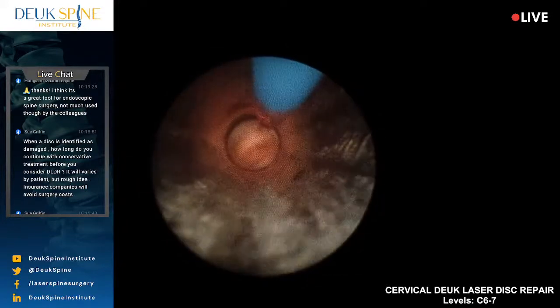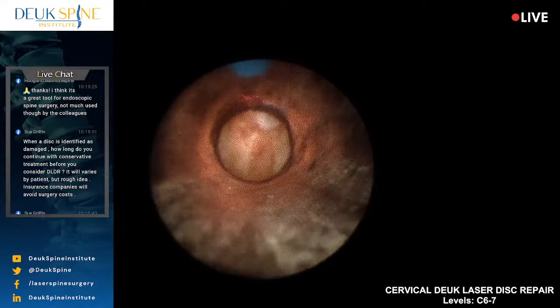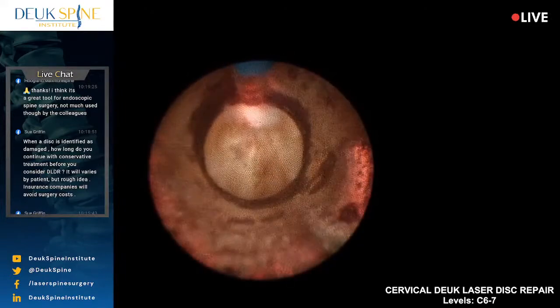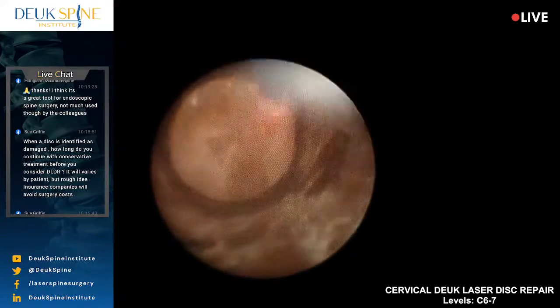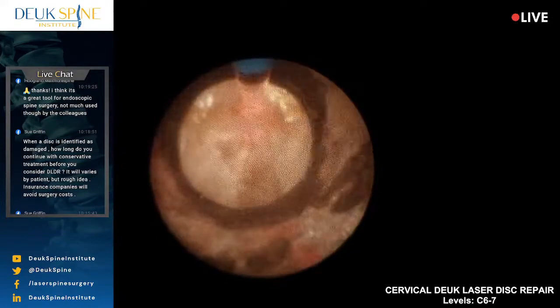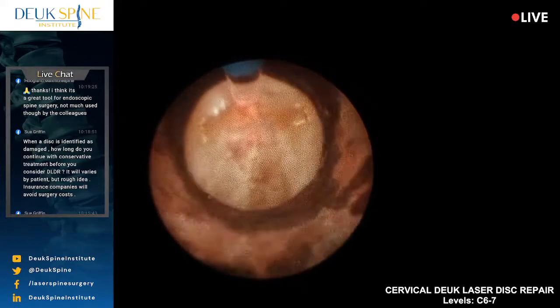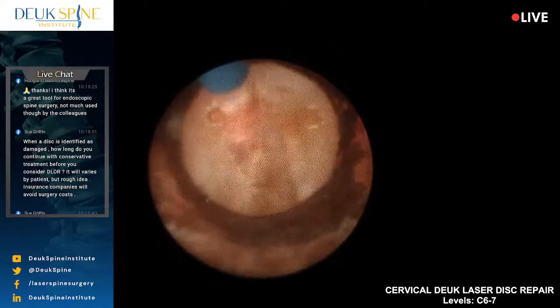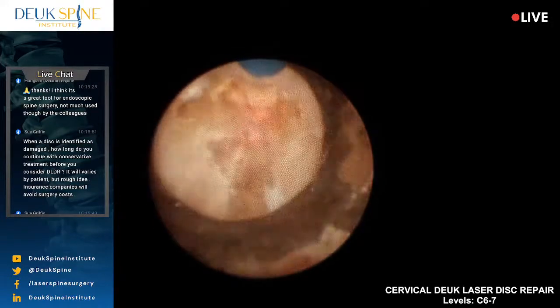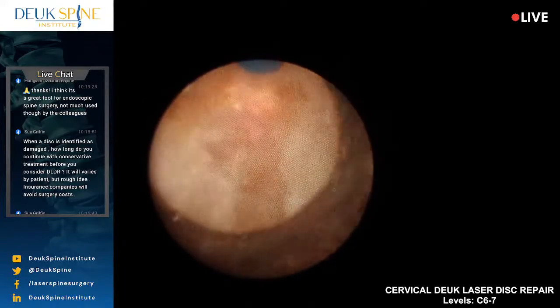Let's go back the other way. So I'm going back and forth, side to side, and what I'm doing is I'm working on this herniation back here. And you could see just how all that gold color there is all osteophytes, bone spur, calcified herniation, and inflammatory tissue. It's just a bunch of crud that shouldn't be there. And it's all closing on his nerve over there in the foramen.